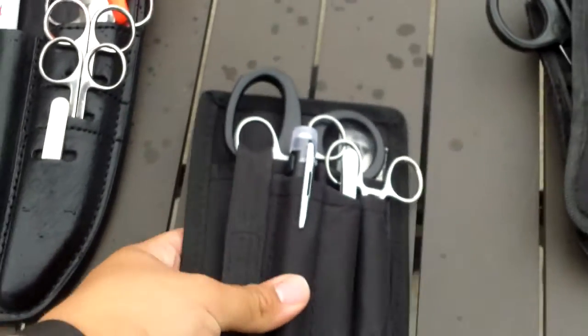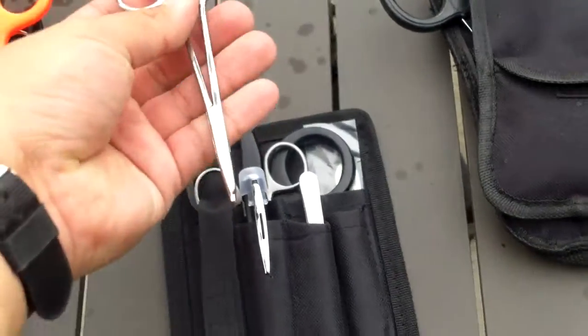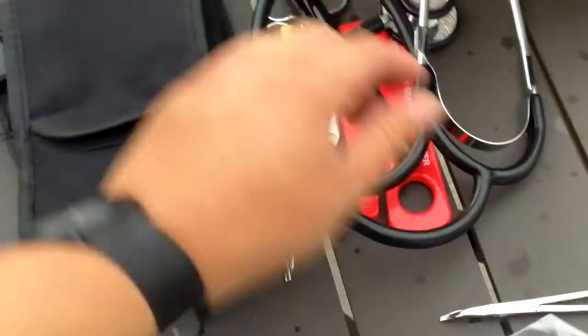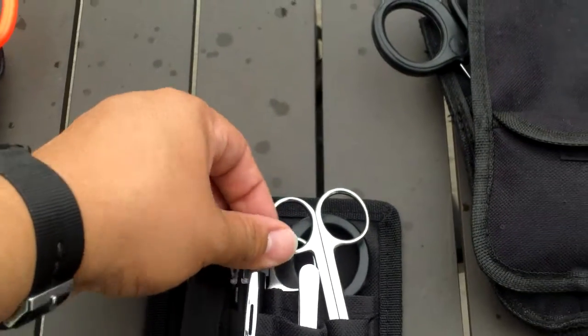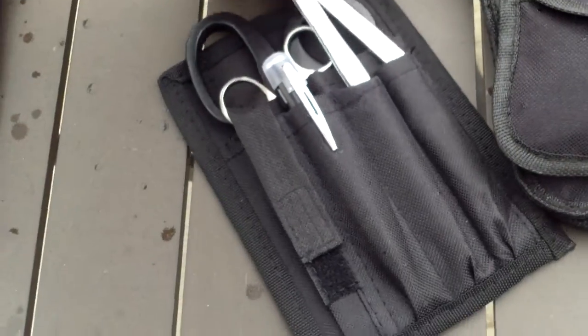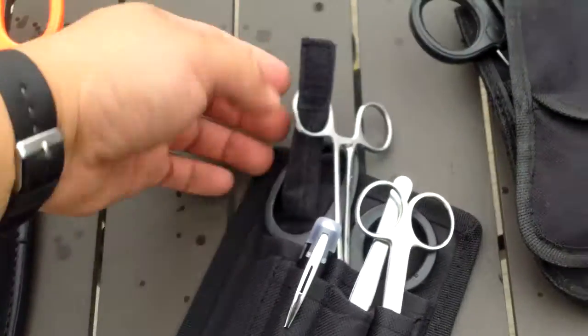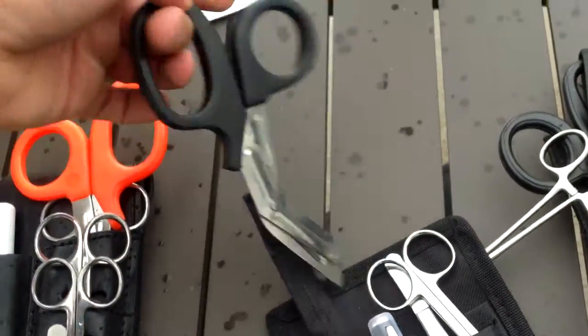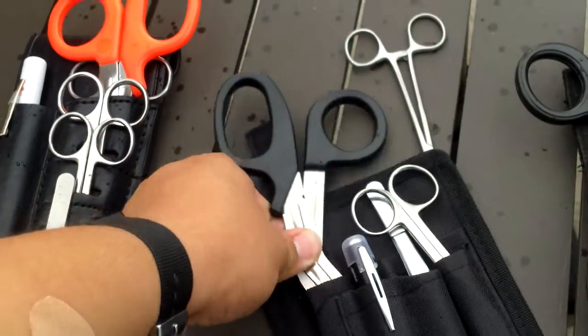This other one is sold by Rothco, and EMI has their style like it too. I've mixed a few things up — in this kit you would have your disposable pen light, but this one is a reusable one. The tweezers don't have much grip to them so I don't like them. These are the same bandage shears, and of course your clamps and trauma shears. These trauma shears actually feel more solid than the others, which is kind of interesting since they're Rothco. The overall pouch itself is relatively cheap.